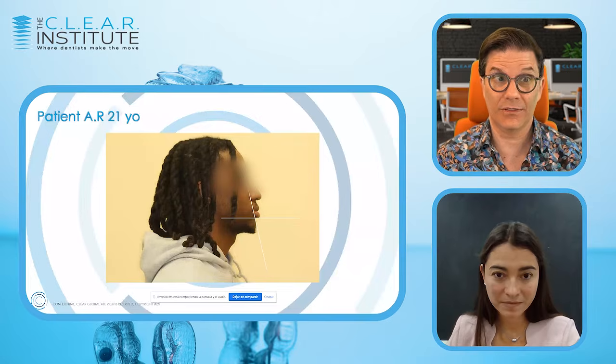I totally agree with you. I think that it's the time where we were only looking at the ceph. If my final ceph looks good, but the face doesn't look good, for me, it's not a success. Yeah. That's it. So at a certain point, yes, we look at the measures and everything, but you have to treat to the face. And like you said, exactly, patients are more concerned now about the look and everything. Yeah. And it becomes important.